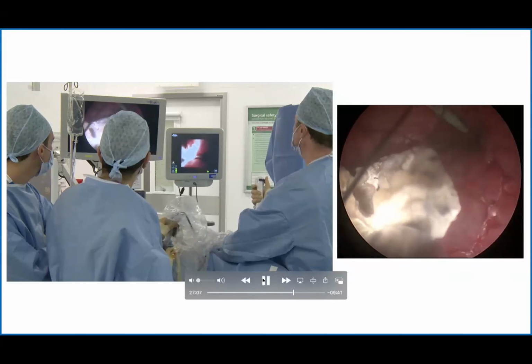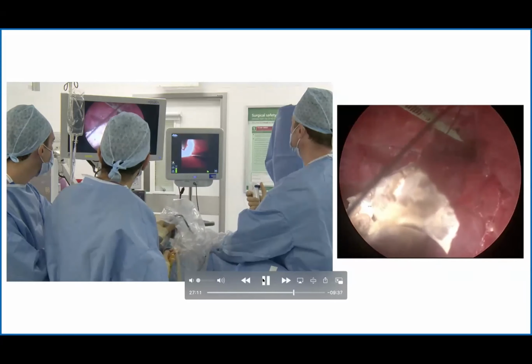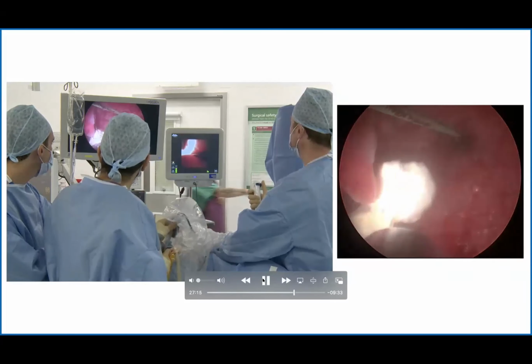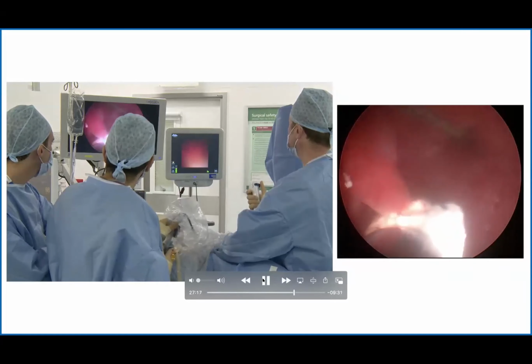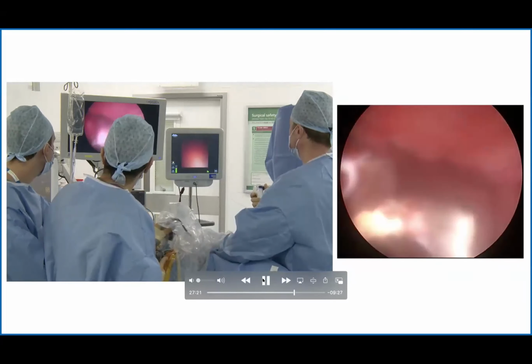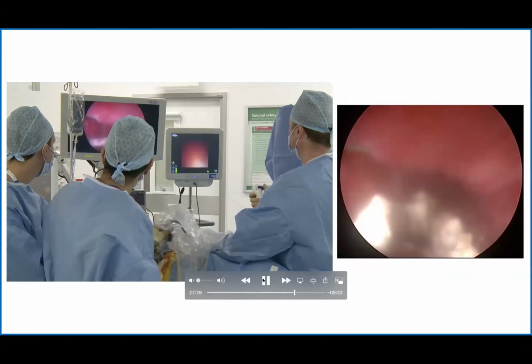So just on that point, because it ties in nicely with a comment that Kay's made, you've got two consultants there, a trainee, and you're using kit from below for the endoscopic combined part. You've obviously got percutaneous access, nephroscope, Trilogy, and it's just a question about costs, really.